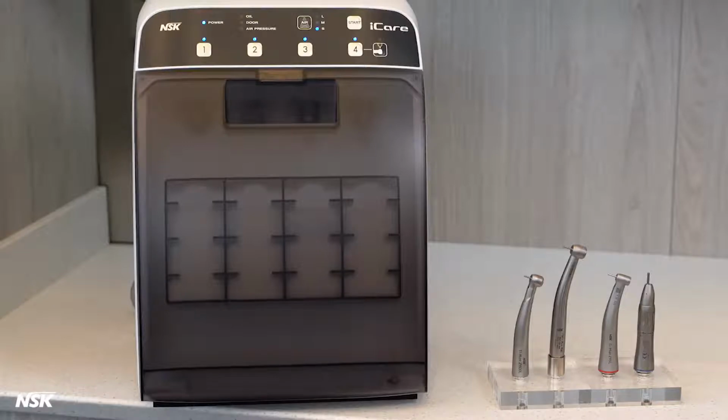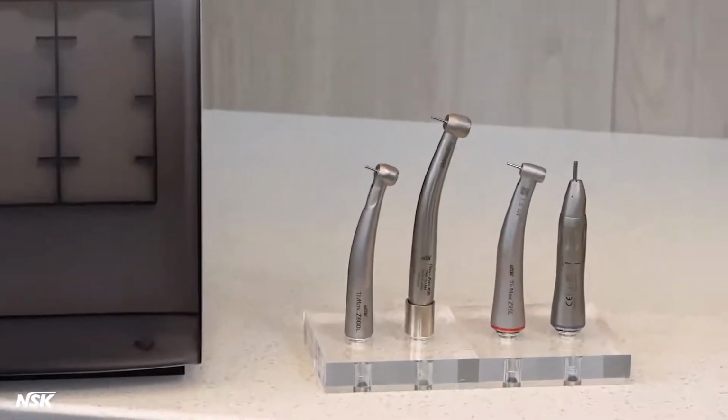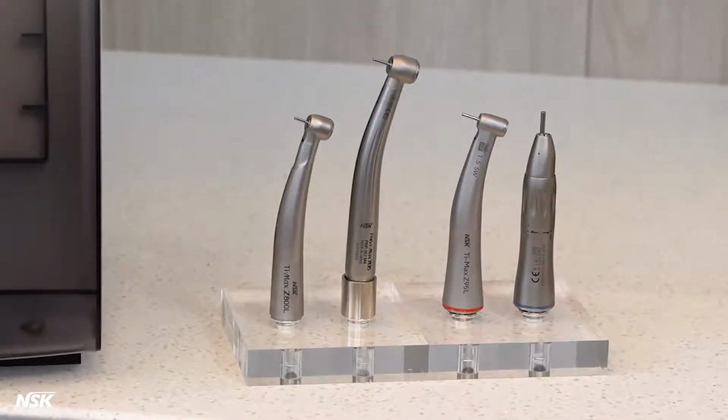Operation. Now that your iCare is set up, it's time to lubricate your handpieces. For this demonstration, we will lubricate 4 handpieces. Z800L, high-speed air-driven with NSK backend. Pana-Max Plus, high-speed air-driven direct connect. Z95L, electric attachment. X65, straight nose cone.